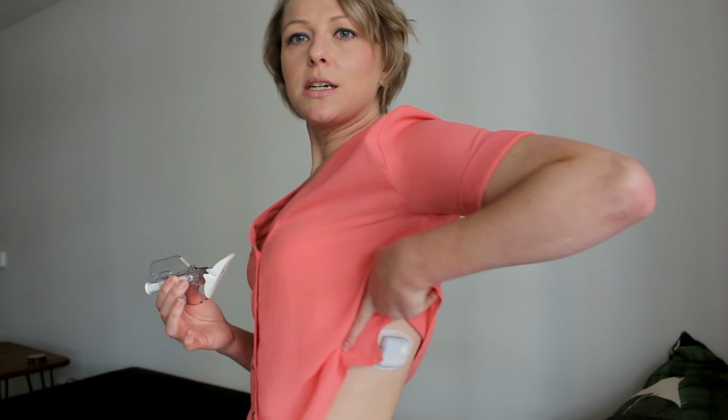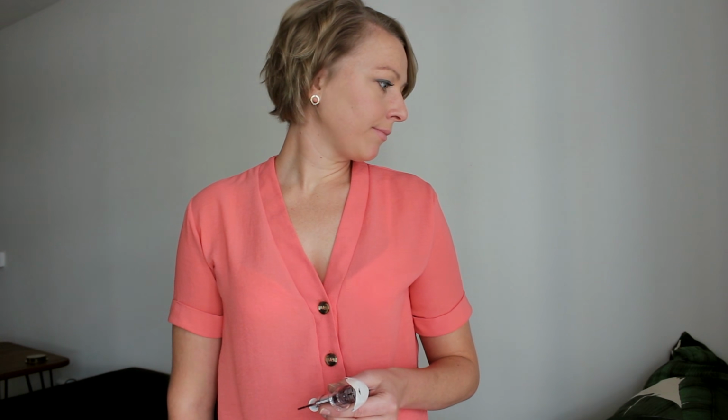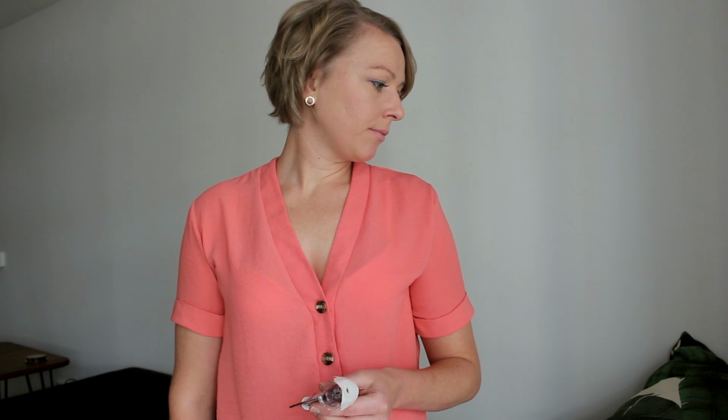The approved site for a Dexcom sensor is your stomach area. That's actually where I normally wear my Omnipod insulin pump, but you need to keep the sensor at least 3 inches away from your insulin pump or injection sites. So I'm trialing my Omnipod, just there, which so far so good. This leaves the stomach area clear for the Dexcom sensor. The ideal sensor insertion site for you may be based on your body type, activity, sensitivities, and other personal traits.